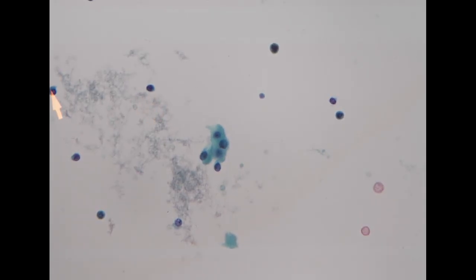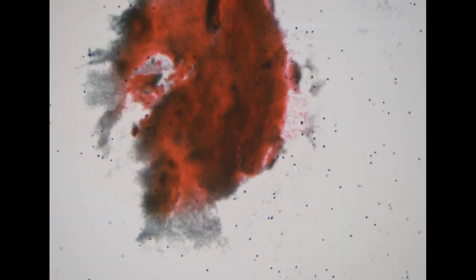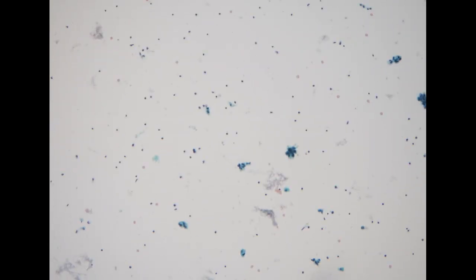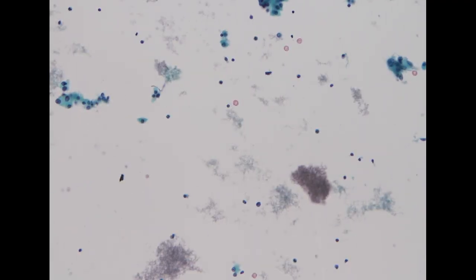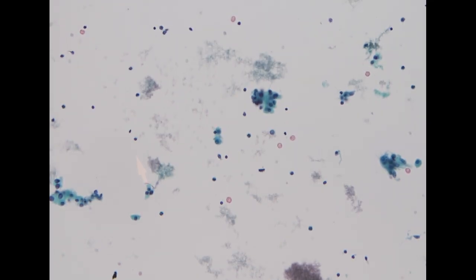And in the background, you can also see some plasma cells, some lymphocytes. So sometimes in Hashimoto thyroiditis, the nodular lesion can be very prominent, and it can mimic an oncocytic tumor, and it is very difficult to differentiate with cytology alone, because you definitely see more Hürthle cell clusters, and these features are similar to what you can see in a Hürthle cell neoplasm.